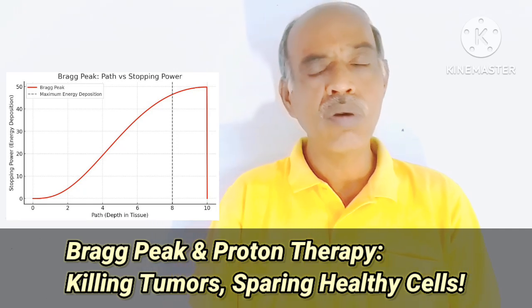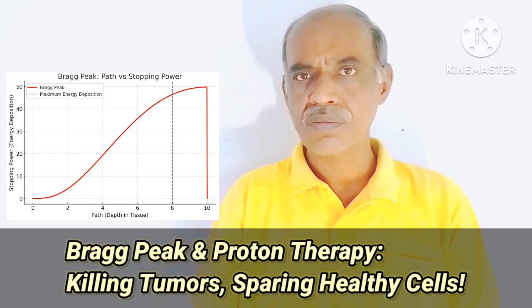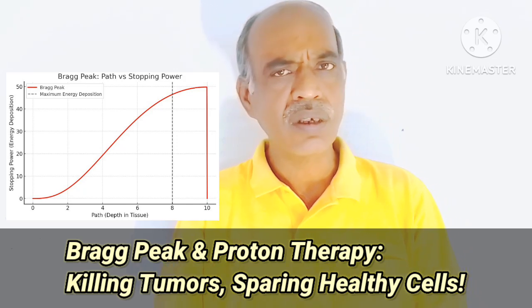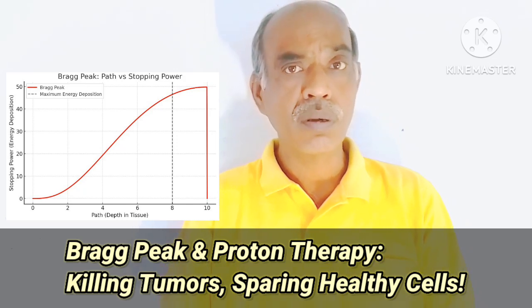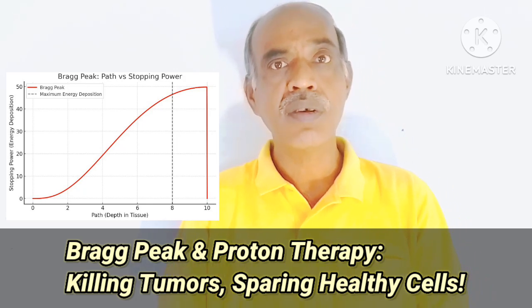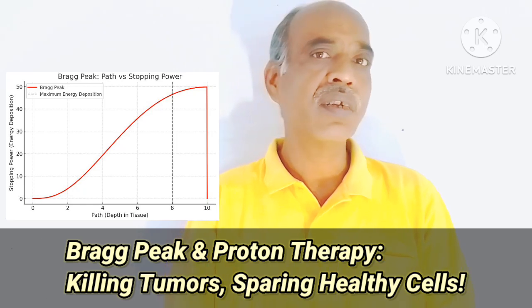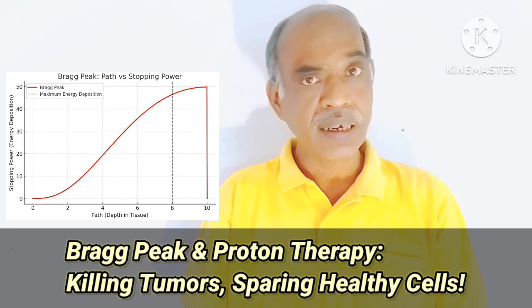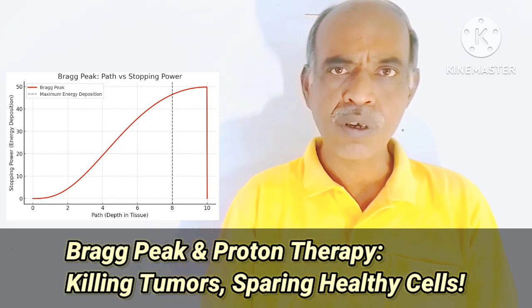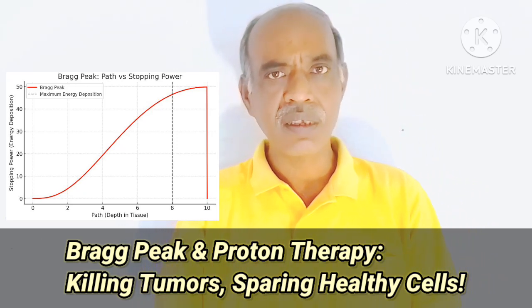And one more thing is, children are more sensitive to radiation. So that's why, since children are very sensitive to radiation, for the treatment of pediatric cancer, this treatment procedure, proton therapy, is best. So these are the plus points. Targeted therapy is one plus point. Minimal side effects is another plus point. And this is best for pediatric cancer treatment, that is the third point.